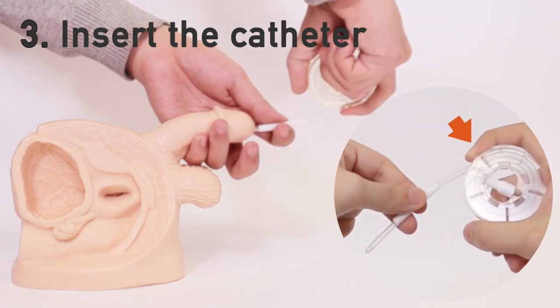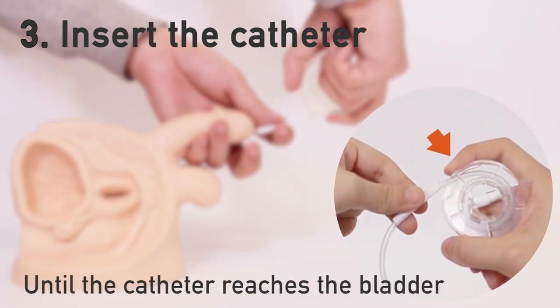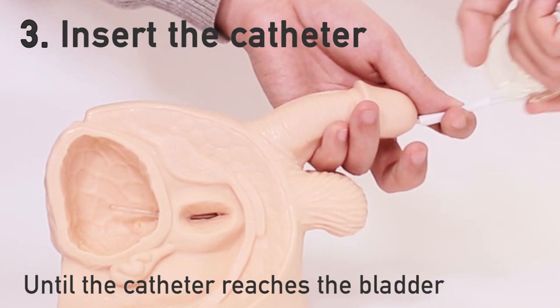Advance the catheter by pressing down on the handle while holding the sheath until the catheter reaches the bladder. Before the catheter reaches the bladder, you might feel some resistance.